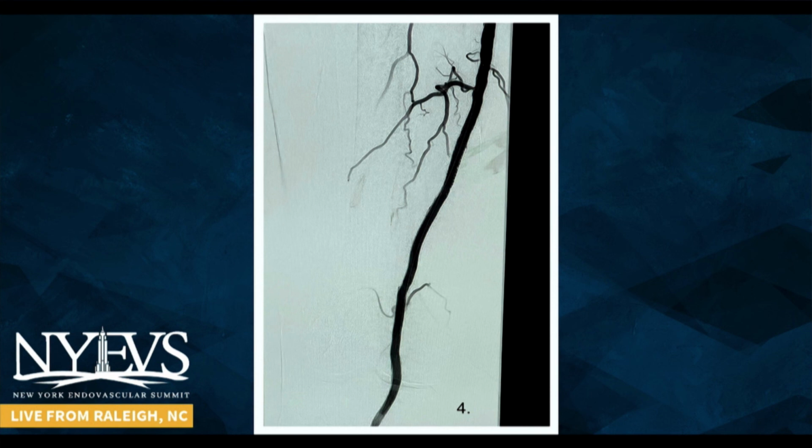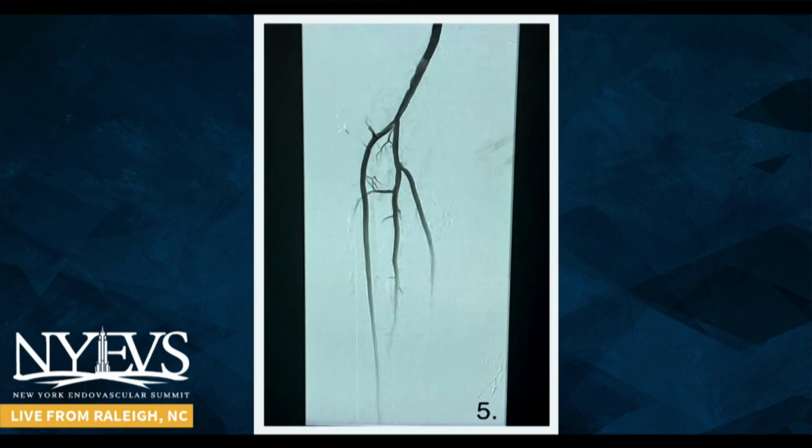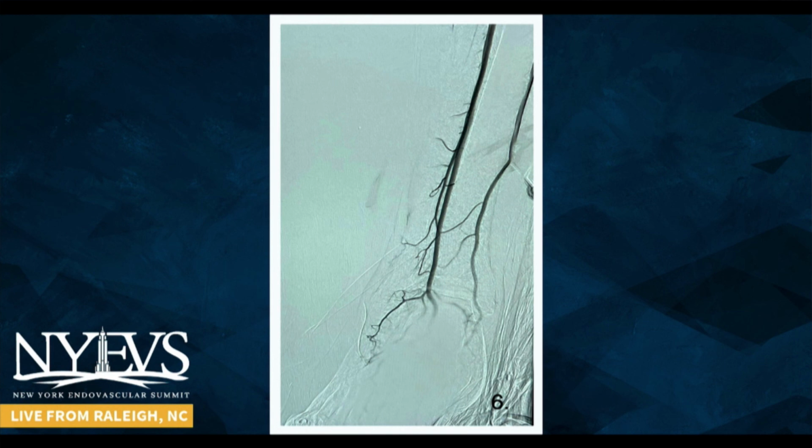Wow. 2 5.5 by 150 Superas and 1 6.0 by 100 Viabahn that we used proximally. Next slide, please. And I think you can appreciate that nice distal popliteal P3 segment into the anterior tibial, TP trunk, 3-vessel runoff. Next slide, please. Just to show us going into the foot. And then the last slide, please.